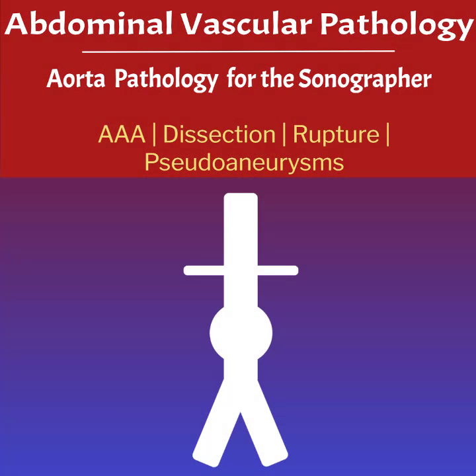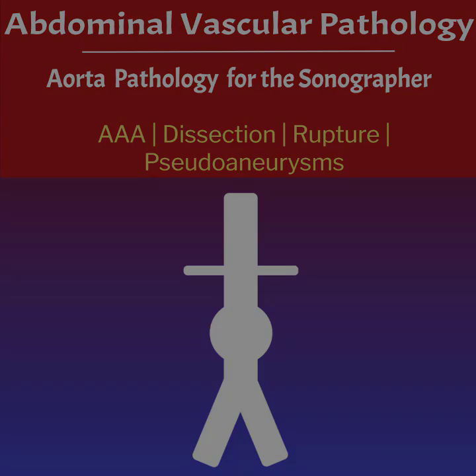Welcome to our sonography lecture on abdominal vascular pathology, part 1 of 5. This lecture will focus on aorta pathology, including aneurysms, dissection, rupture, and pseudoaneurysms.